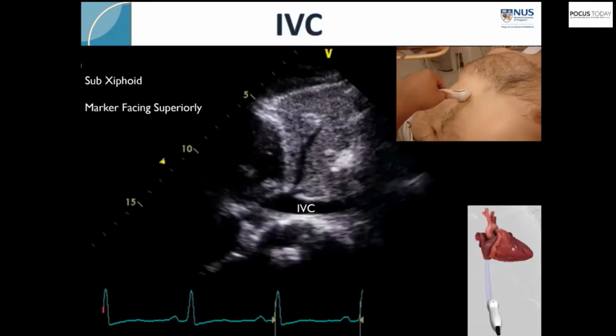The inferior vena cava is described here, although it is more relevant for assessment of preload. This view is obtained in the subxiphoid area with the probe placed longitudinally over the upper abdomen. The IVC is seen as a non-pulsatile structure or vessel that drains into the right atrium. IVC diameter can be measured 2 cm distal to the RA-IVC junction.